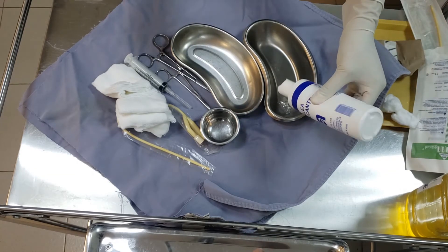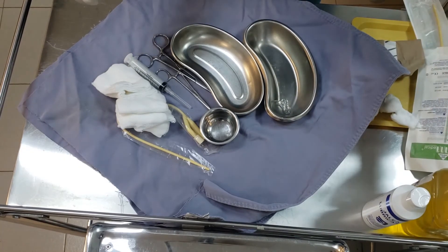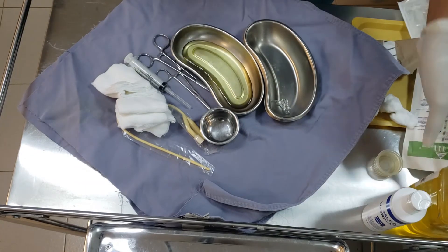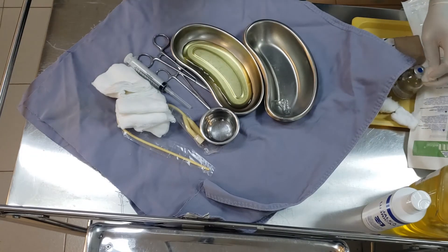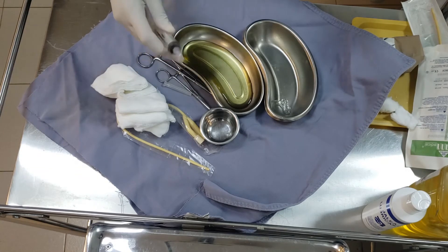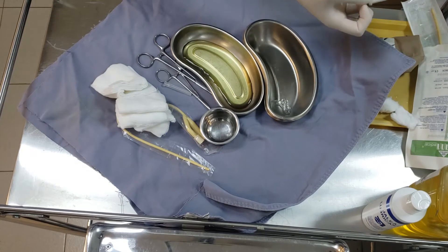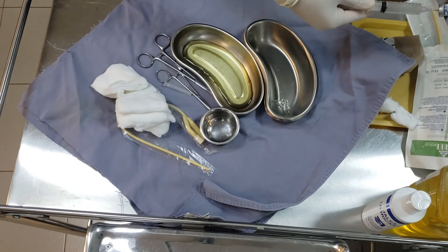Your clean hand will uncap and pour the fluid, dispense the lubricant, and wipe and dispense the sterile water. For pre-packaged kits, you would have pre-filled syringes. In our local context, you will have to prepare a 10cc syringe with sterile water when you open your tray. Just remember to pull back on the syringe and inject air into the container before you withdraw fluid to avoid creating a vacuum in the container.